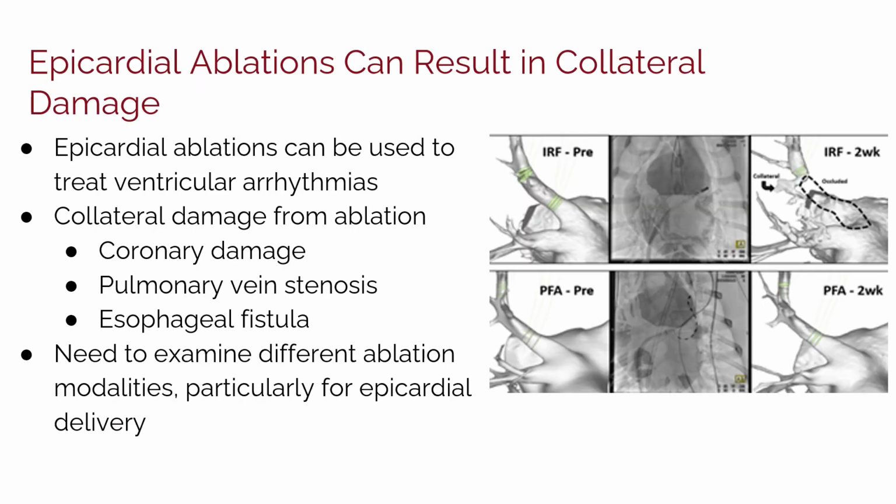Cardiac ablations have been used to treat cardiac arrhythmias for several decades. The typical way to deliver this ablative therapy is utilizing radiofrequency. Radiofrequency has been known to cause stenosis of vessels in preclinical studies and in clinical studies.